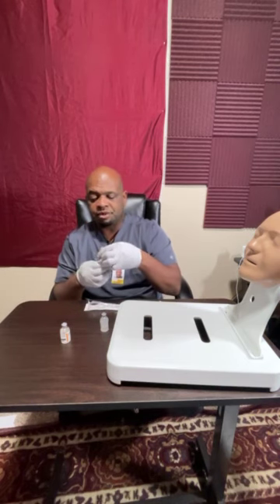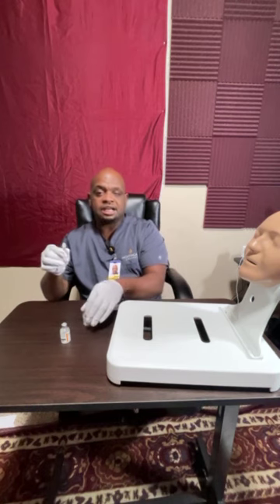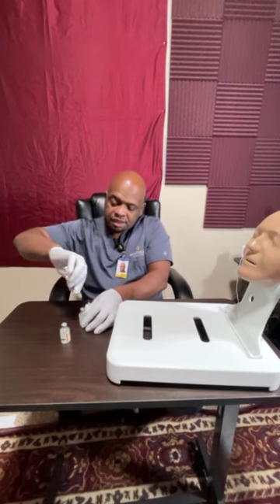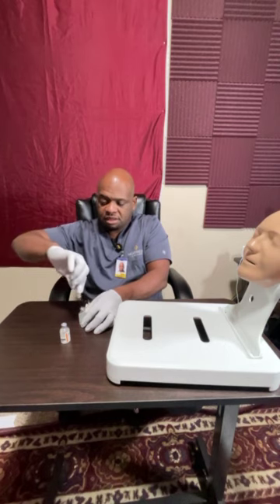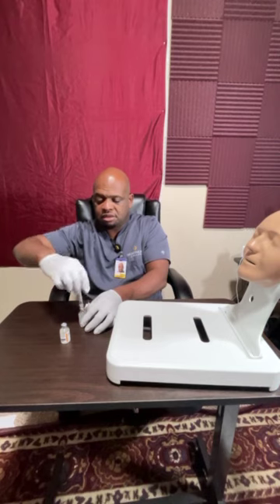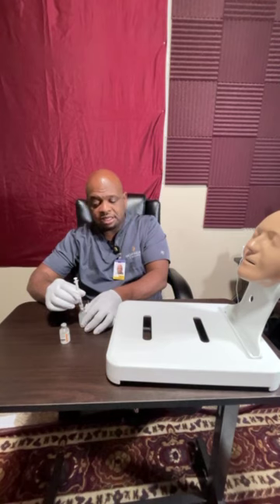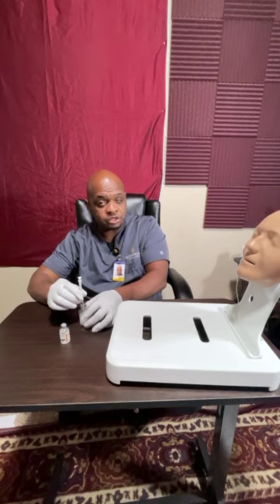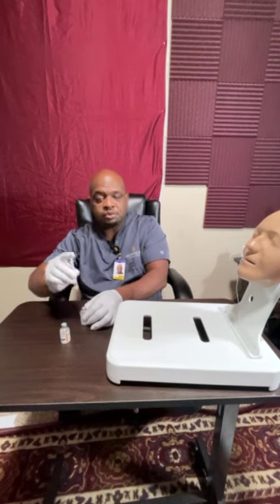Right, we're going to take the top off. With my non-dominant hand, I am going to hold the bottle still as I place the syringe into the bottle. Okay, 8 units. Now, I am not going to tilt this bottle. It's important that the needle does not come in contact with the solution. I'm only putting air in, right? So the air is put in there. I'm going to pull that out.